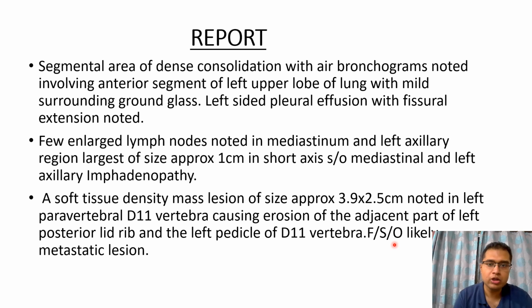So it's very important to look at the complete picture without any bias, and also not ignore the patient's symptoms. Here she had complained of backache, which my technician actually mentioned when he was preparing the patient for the CT scan. She kept complaining of backache as well, and this was an important finding to be looked for in this case and reported.